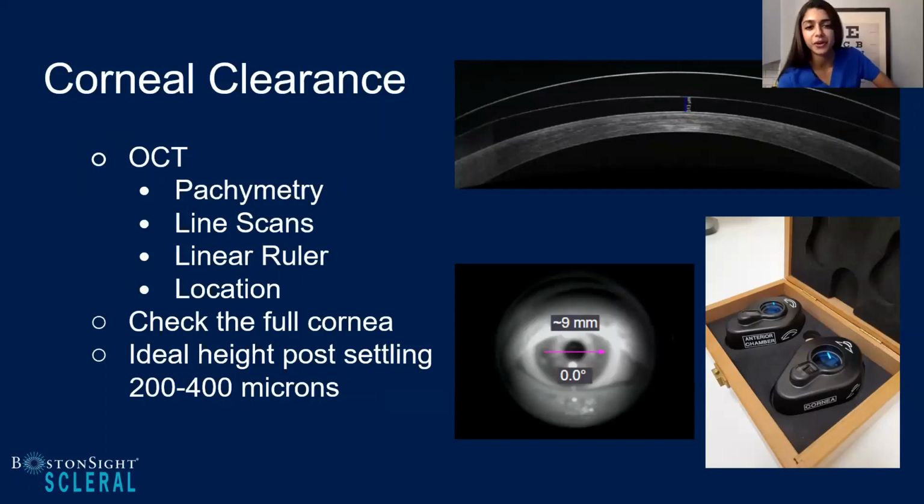Shalu, here's a question for you. At what point do you actually evaluate the central clearance of the scleral lens after you apply it on the surface of the eye? Yeah, it's a good question. So when I initially put a lens on, I want to very quickly do quick scans of the cornea to see, okay, do I have touch anywhere? If I don't have touch, then I'm going to go right ahead and let that lens settle.